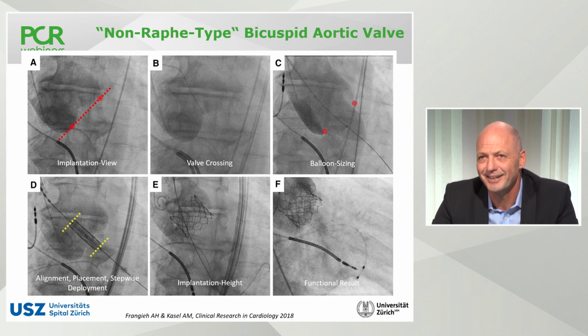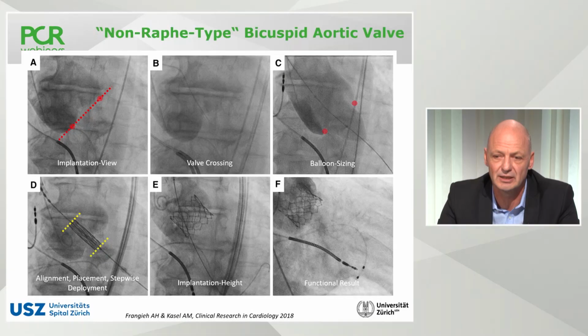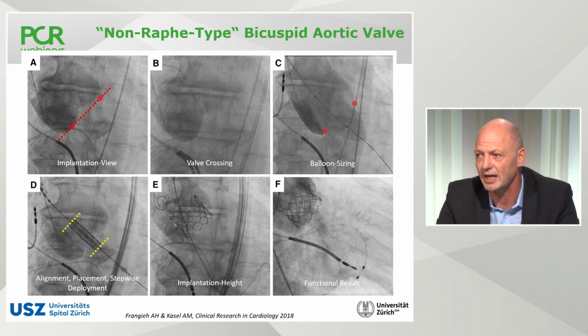That's exactly what I was going to ask you, because the CT scan tells us which imaging plane to use. The predicted view is based on measurement in a CT, and with 2 commissure points, the alignment is difficult. Most of us use 3mensio software. It's based on a centerline analysis, but it could be misleading. And what we learned is that annulus size is often overestimated.